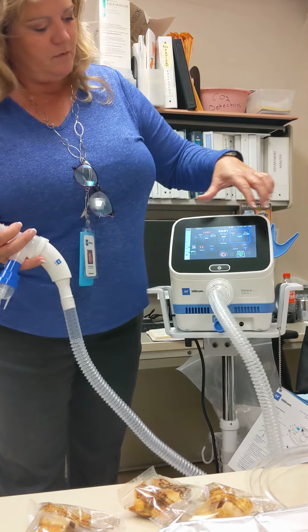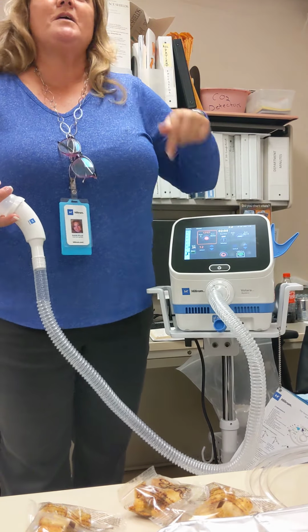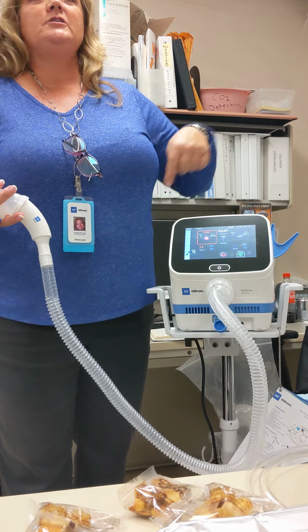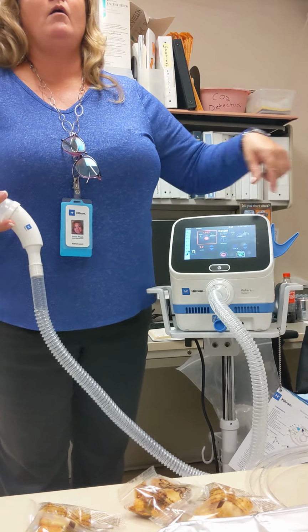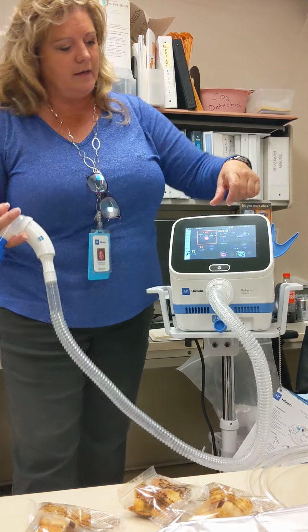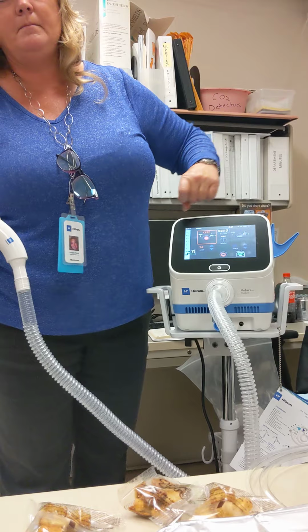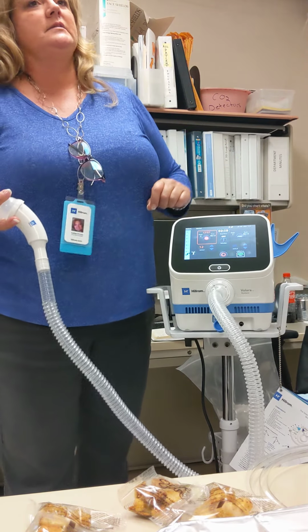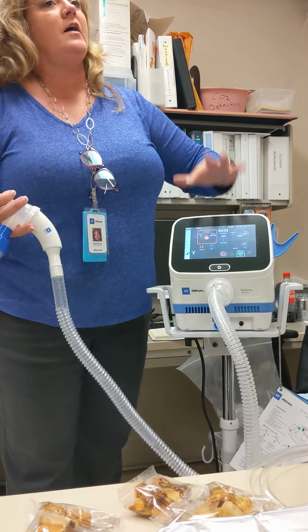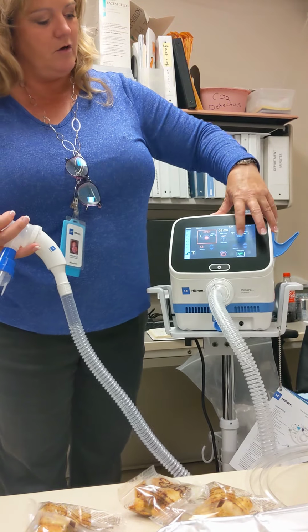Now you're talking them through. Now we go back, and this is a welcome break. They were complaining before, right? Now it's like, oh, thank God. And that's where you go back and forth. Up here you will have stages of your time, and then your total treatment time. I would document your stages of how much time you're at each level, and then you can go back to oscillation.